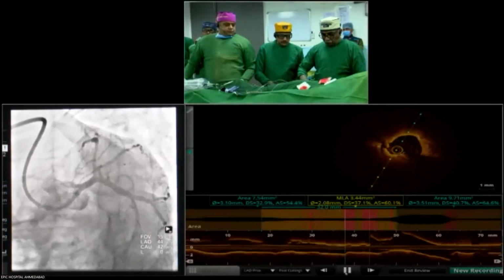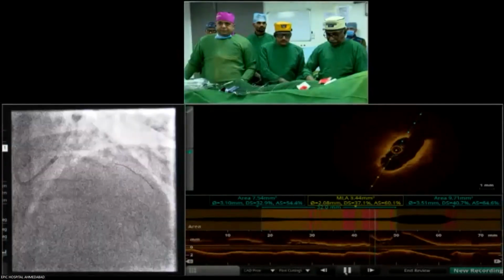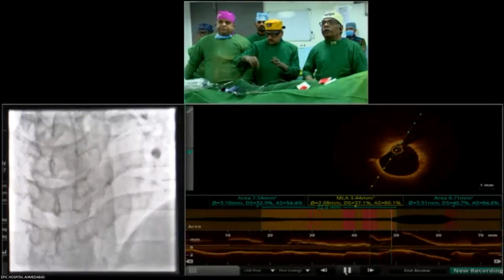Okay. If you are going to stay with me, give me 30 seconds. My balloon is going to get in within 30 seconds. Just finish off and then we'll move on. So my POT balloon will come.